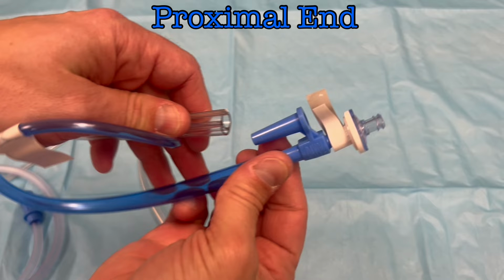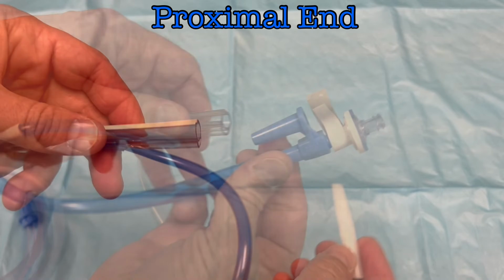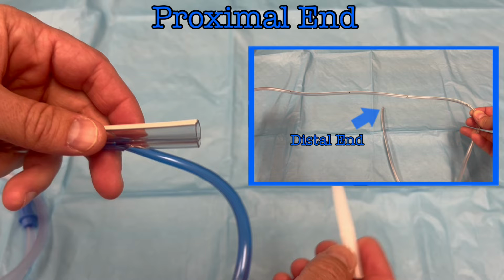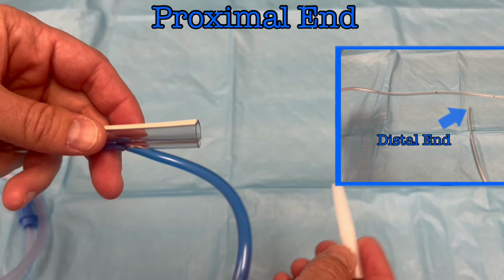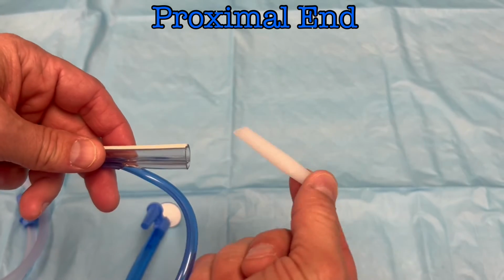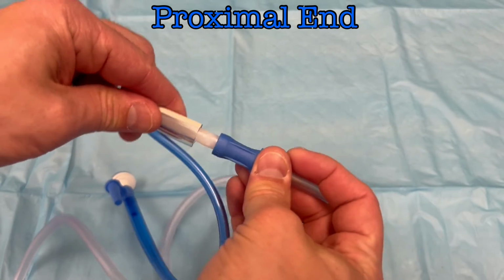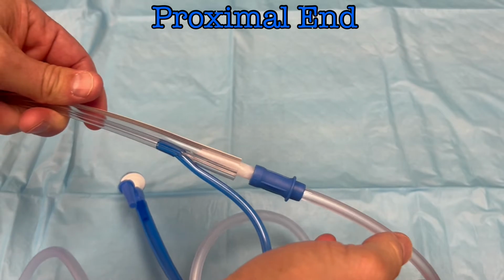The proximal end of a Salem sump design, like the one used in this video, has two openings. The first is the large opening at the end of the clear tube. This allows access to the end sitting in the stomach with all the holes that we already looked at. It is how you will deliver treatment, or remove gastric contents via suction. The plug that is inserted into this tube is an adapter that allows you to connect the NG tube to suction tubing, if suction is ordered.